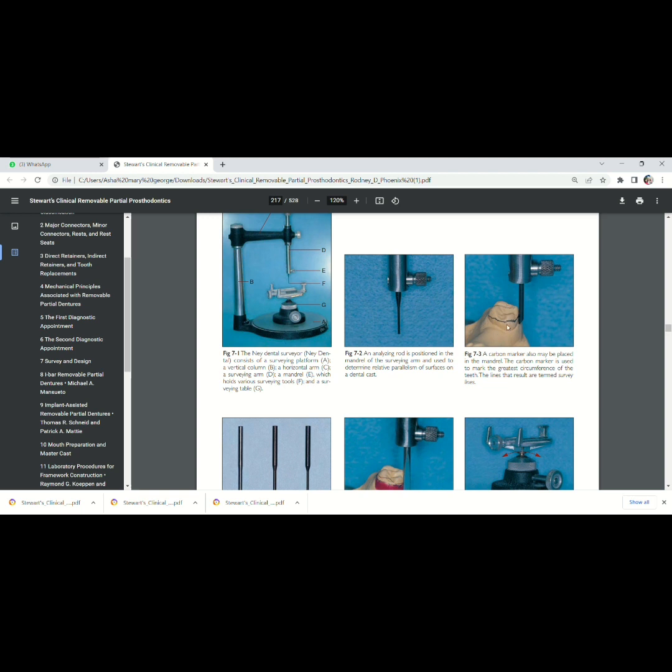So if we place this cast over here and bring the analyzing rod onto the labial aspect or the lingual aspect of the tooth, we can see since the tooth surface is convex, only one part is contacting with the analyzing rod, or even the carbon marker.